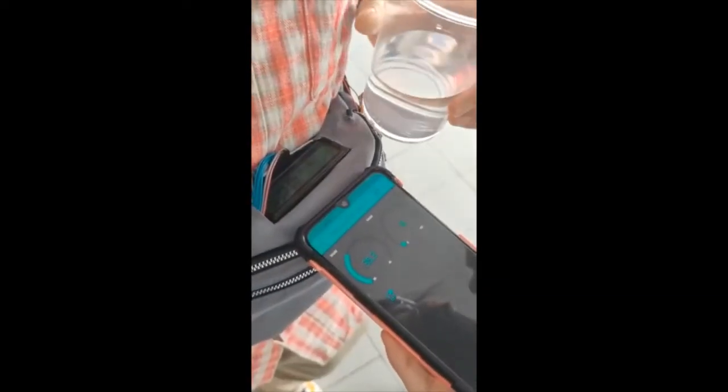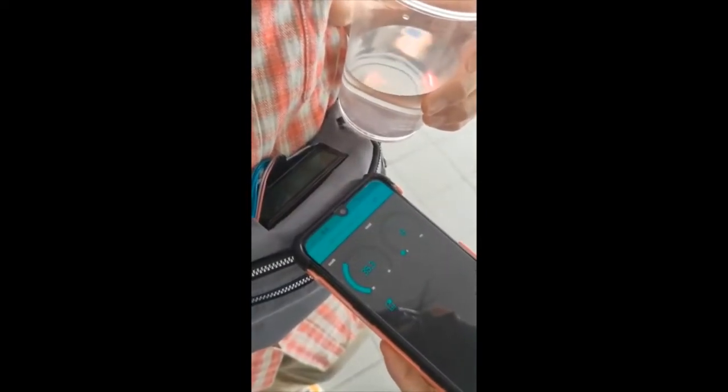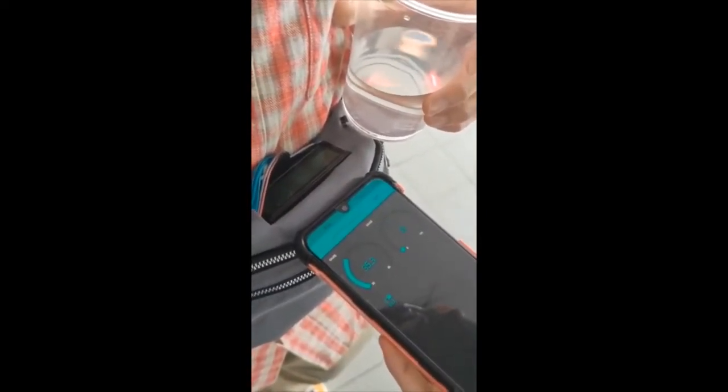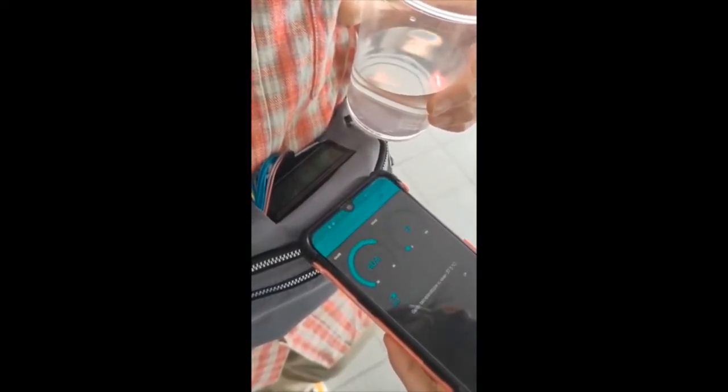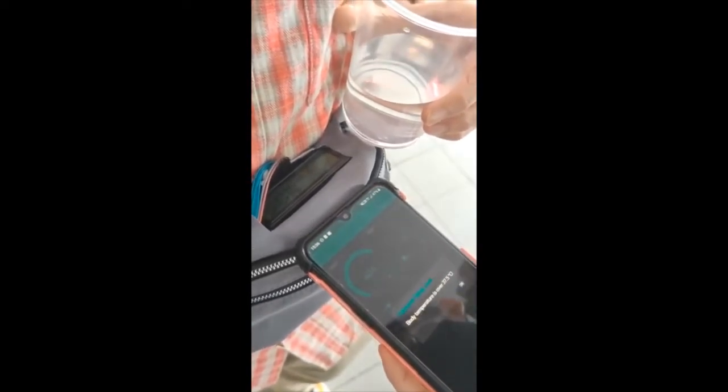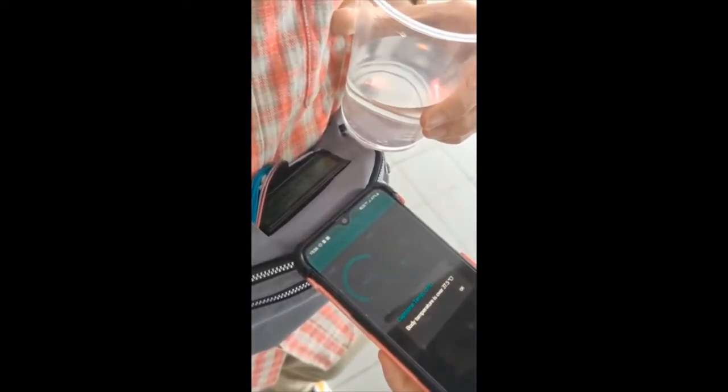We will show what happens if the temperature is higher than 37.5 degrees Celsius. We used hot water to increase the temperature. The notification is being displayed.